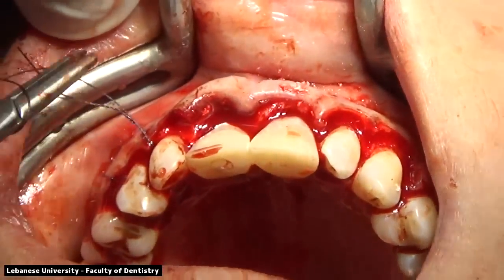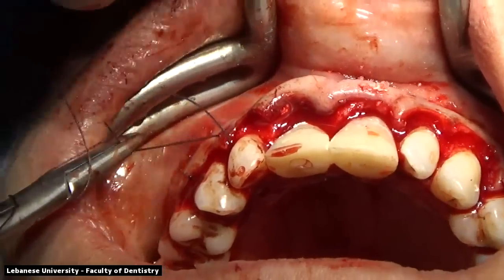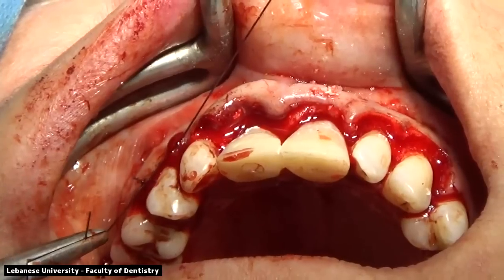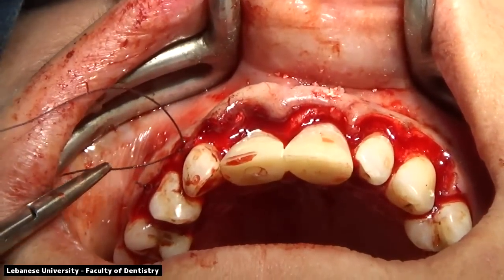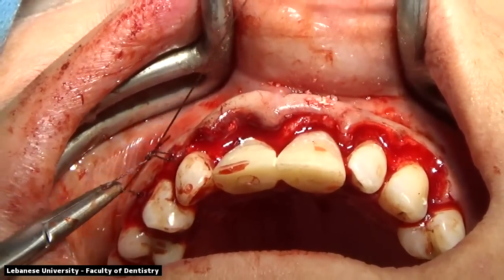The level of the crest of the bone of the buccal should be 2 millimeters away from the cementoenamel junction of the neighboring teeth, which gave us the indication and the reference of where we're going to place the level of our implants in this case.